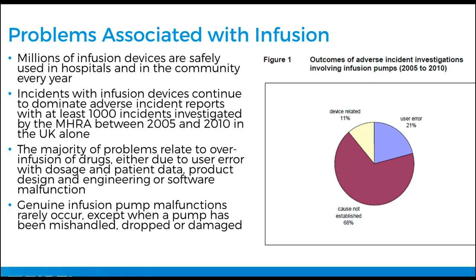So being the biomed, we pretty much always know that when a medical device comes back in for service, either from planned preventative maintenance, or if it was to come back from a non-scheduled maintenance for repair or whatever, typically you would do your periodic check, or at least it would be periodic if the manufacturer was to suggest and advise that an infusion device should be calibrated or at least verified every year. But it all depends on what risk factors. If it is unscheduled maintenance, then clearly it's going to be after the repair.